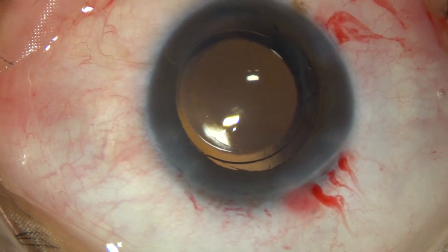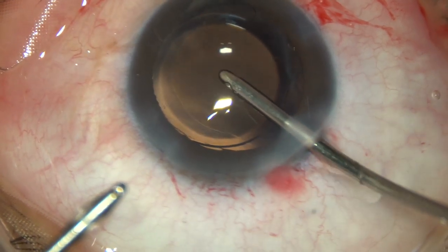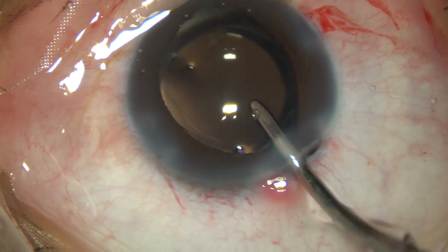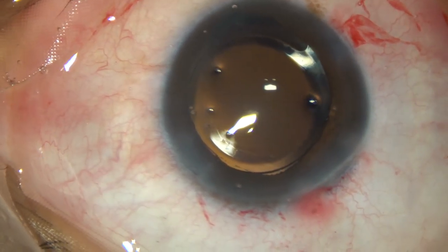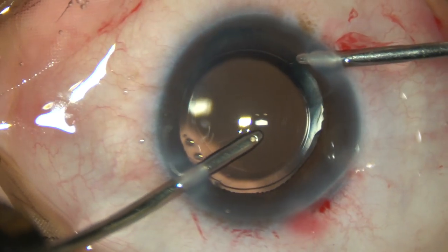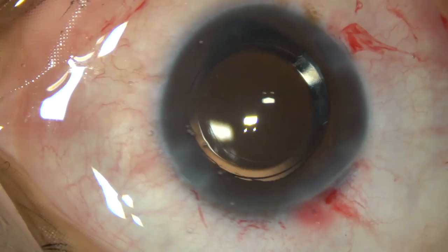Now I take the bimanual irrigation-aspiration and do some more lavage of the anterior chamber — first irrigation only, then irrigation and aspiration together. Quality time has been spent to remove viscoelastic from the anterior chamber and from the capsular bag.